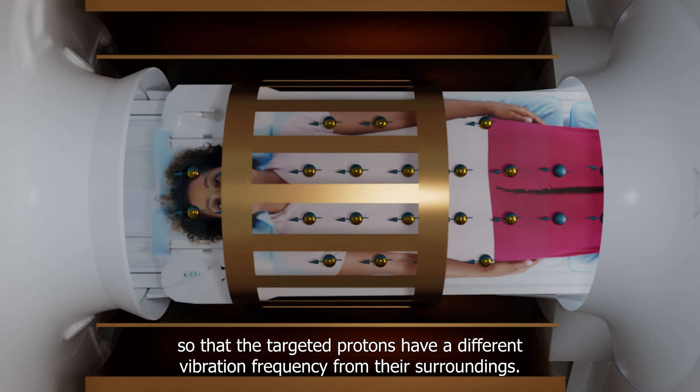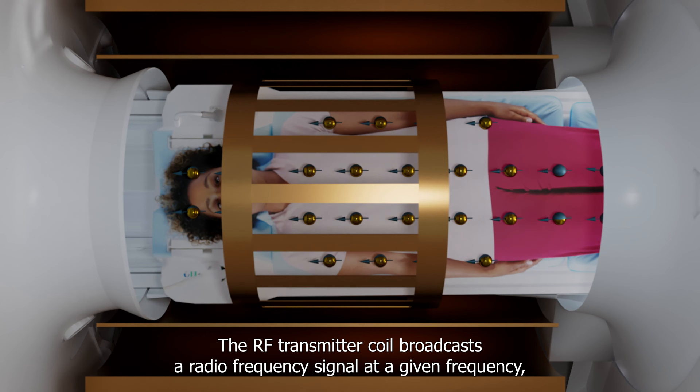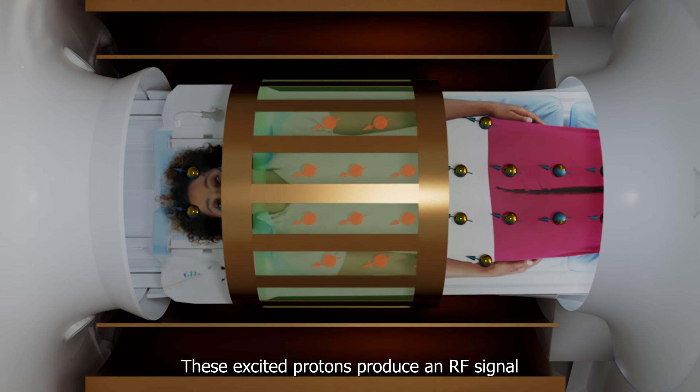This allows localization of the protons, which is a necessary step for the generation of the images that an MRI system produces. The RF transmit coil broadcasts a radio frequency signal at a given frequency, matching the magnetic field strength. This matching frequency is known as the resonant frequency. The targeted protons absorb the RF energy, and these excited protons produce an RF signal which is picked up by the RF receive coil, providing the data needed to create an image.